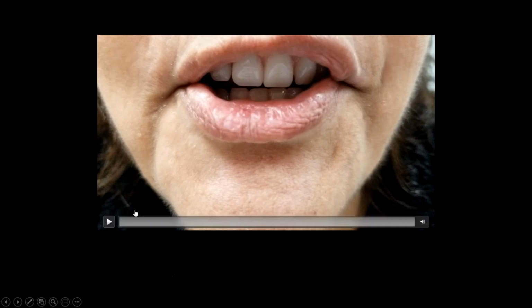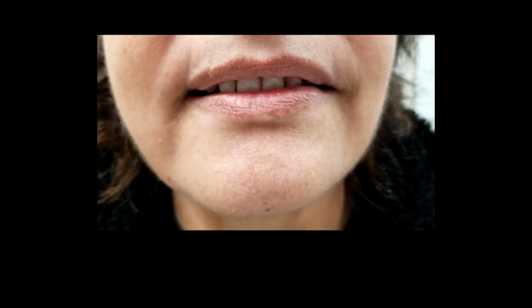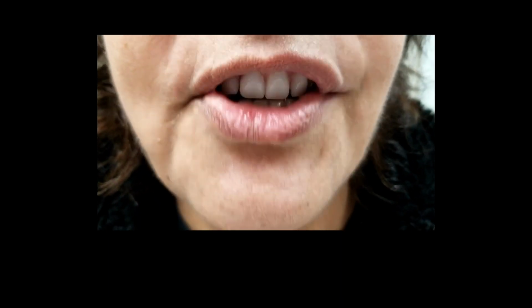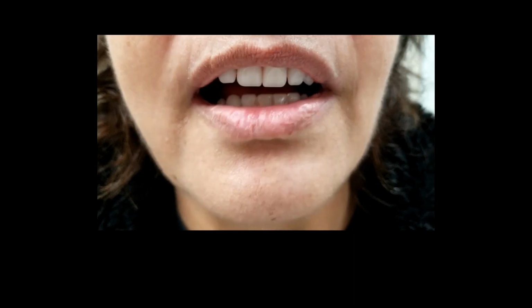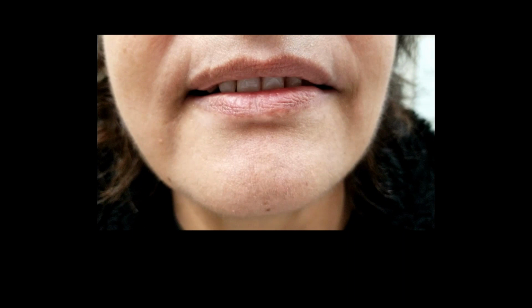So watch her jaw and how it tracks. Did you see it? You see it? You see how she swings out to the left? Look at that. Okay, so now I know I have to clear things out on her left side, which means the guiding planes. So buccal upper, lingual lower for both sides need a little bit more room. And then you can make those corrections and now all of a sudden the denture doesn't move the way it did. So how do I identify this?